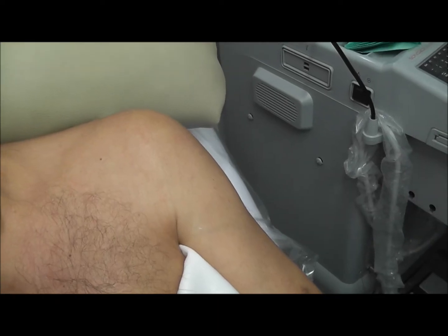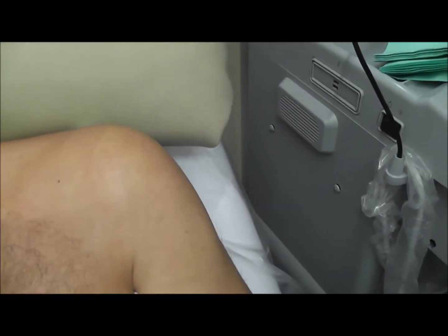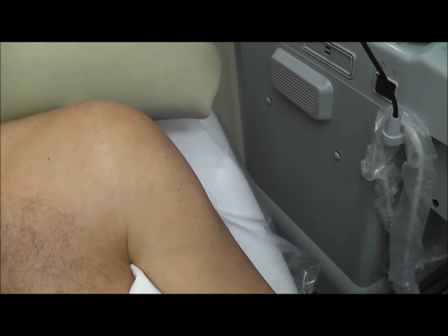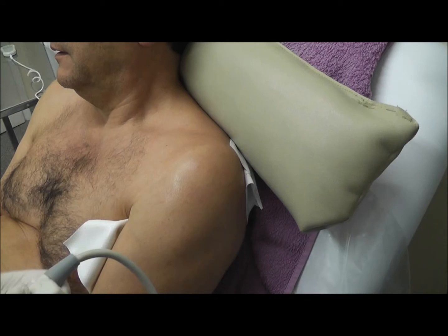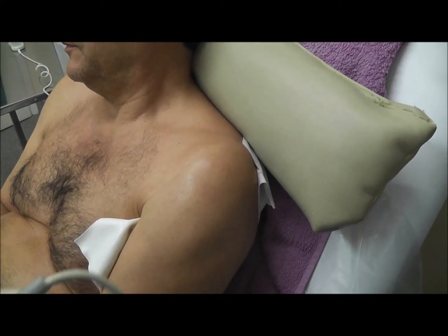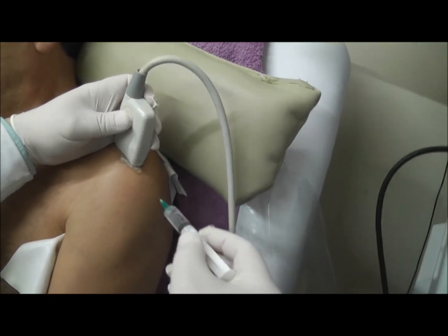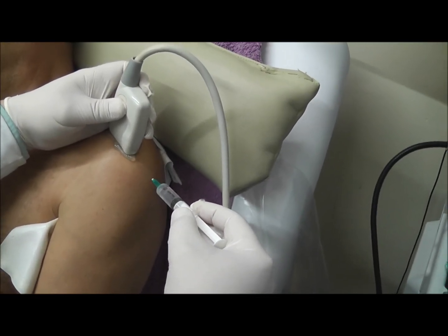The patient has tendinitis of the rotator cuff. He already had a diagnostic test of lignocaine, which helps the movement. Now we are giving a mixture of cortisone and local anesthetic, going into the subacromial space. The position of the needle will also be checked with ultrasound control.